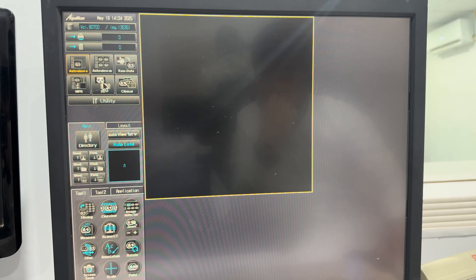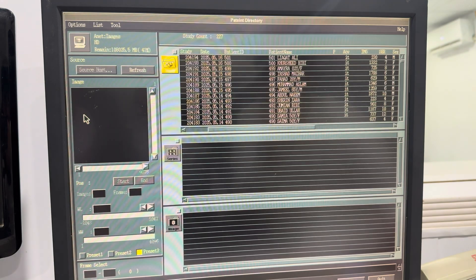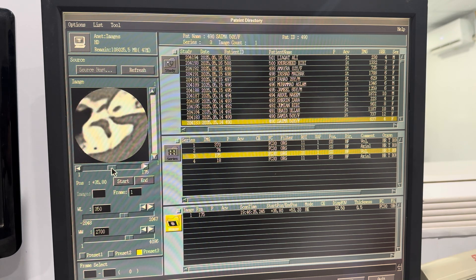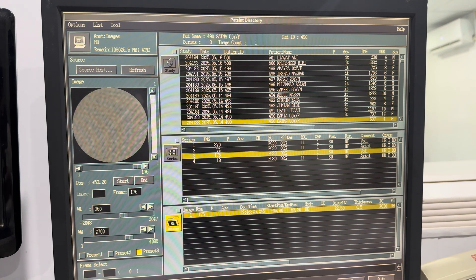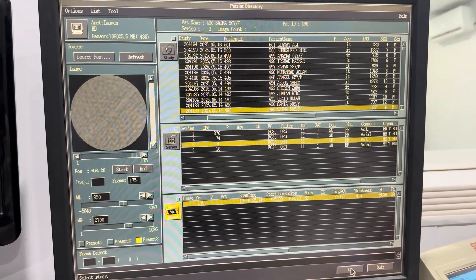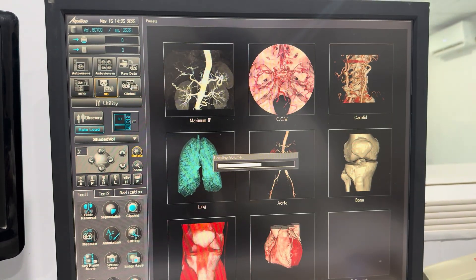After doing so, you will see the directory option — click on it. From the directory, reselect the same patient as before. Then choose the volume that was previously reconstructed using the ROI. Click OK to continue, and allow the system a moment to load.